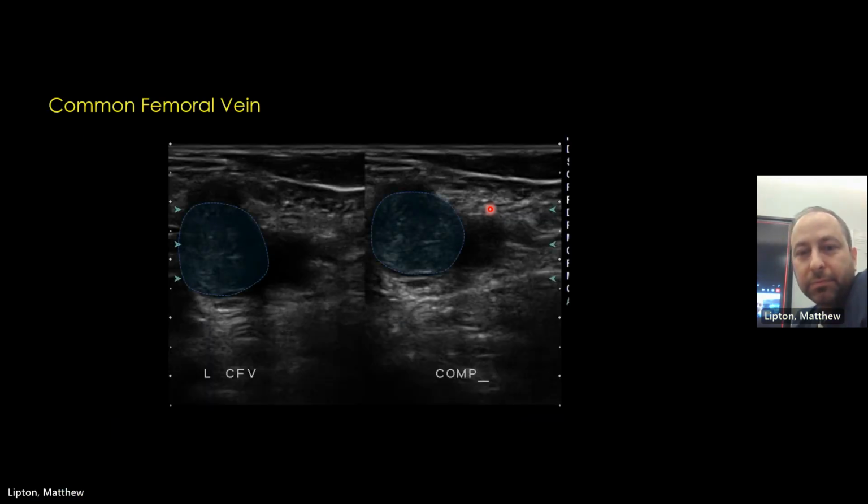Whereas, is this projecting well? Do you mind turning on the lights, please? Yeah. You guys see that here?